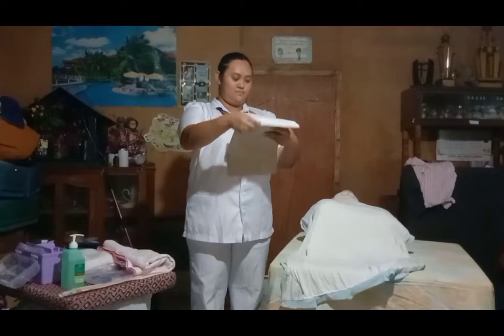First, check the doctor's order for catheterization to ensure that I have the right patient and procedure to be done. Now, prior to conducting the procedure, I have already checked the doctor's order for catheterization. Next is wash hands before preparing the set. This is to prevent the spread of microorganisms that cause disease or contamination.